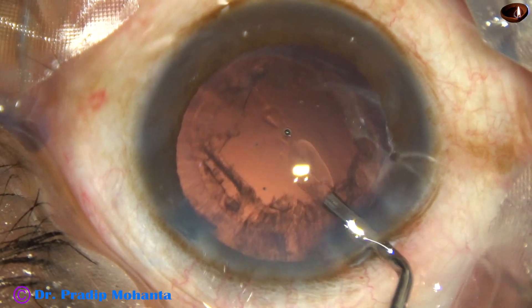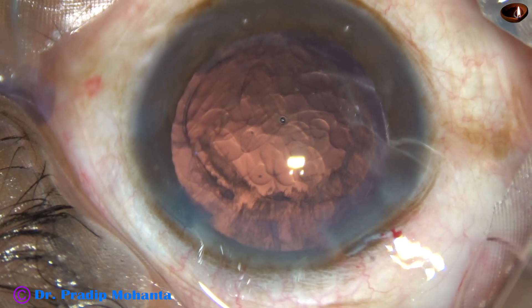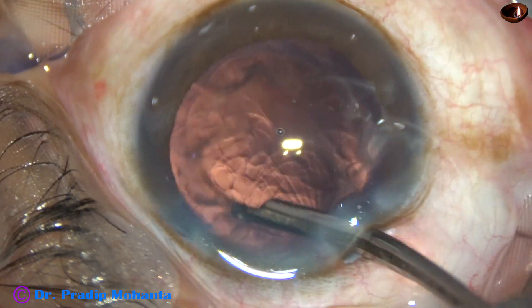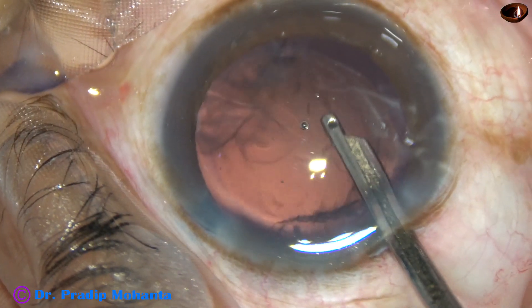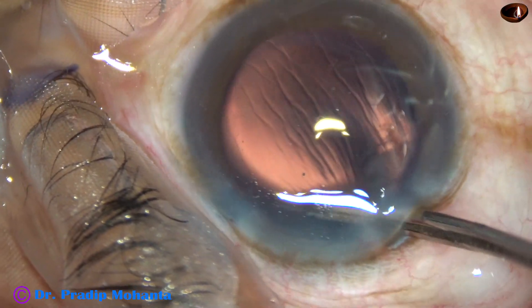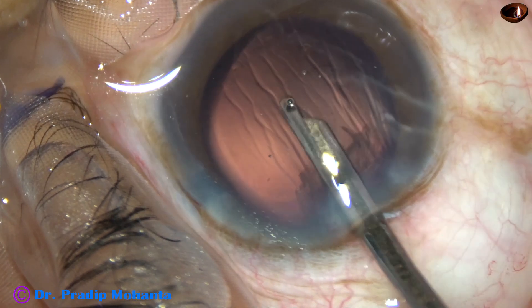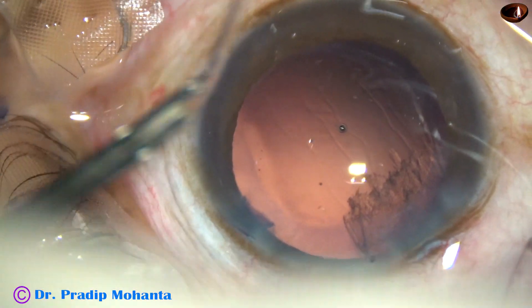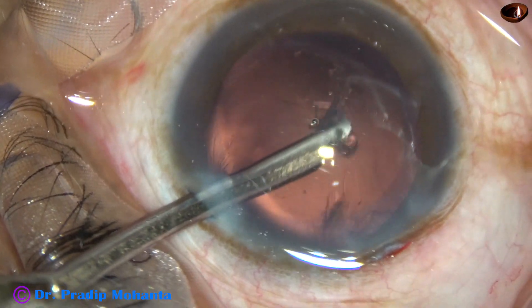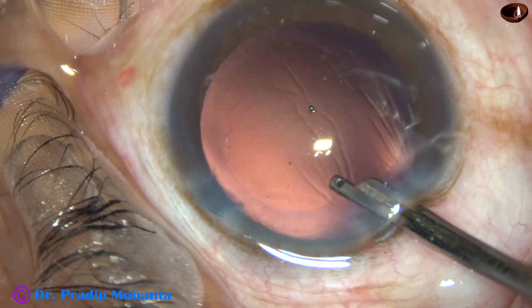Nucleus and epinucleus have been removed. Some more visco is added. Since I have made only one side port, I am going to use this Simcoe cannula for cleaning the cortex. Most of the cortex is removed. The sub-incisional cortex is being removed going through the side port. This is a 23-gauge Simcoe cannula, and the size of the side port is about 1.5 or 1.6 millimeters.